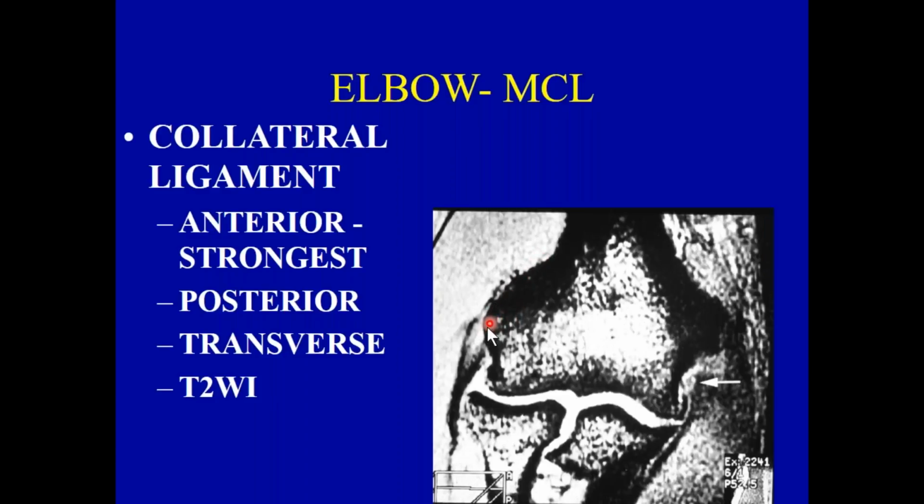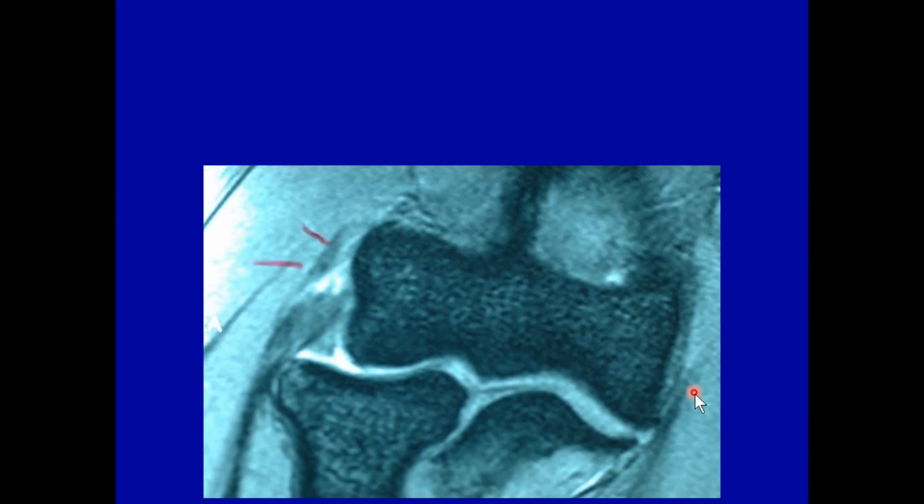And just to give us orientation, this is the outside of the elbow, the tennis elbow ligament, and this is the inside of the elbow, something called the little leaguer's elbow if there's a baseball player who's doing a lot of pitching. So those are patient profiles where you would be called to x-ray the elbow. And it's the same principle that we talked about when we did the shoulder examination. It's a more sensitive tool.